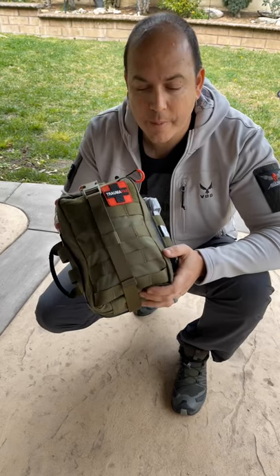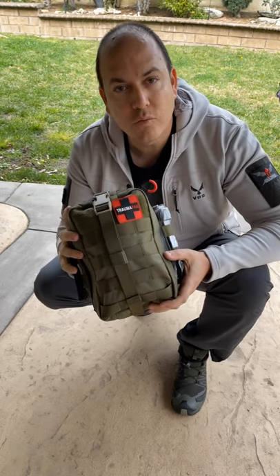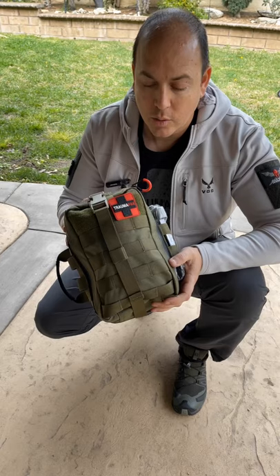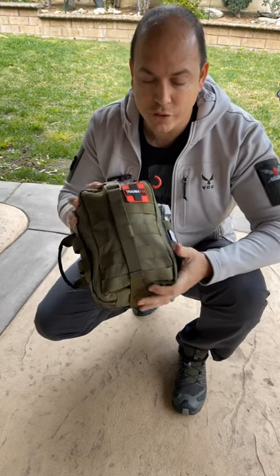Hello everyone. I'm excited to introduce to you the K9 Handler Trauma Pack. This is something we've been working on for a while. We've had so many requests for a really robust, all-inclusive K9 Handler and K9 Trauma Pack, and this is it. We worked hard on this and we're really excited to share with you the bag itself and then the contents more specifically and why we chose them.